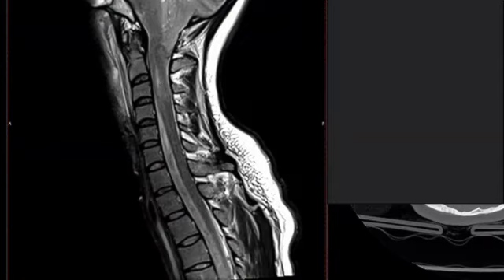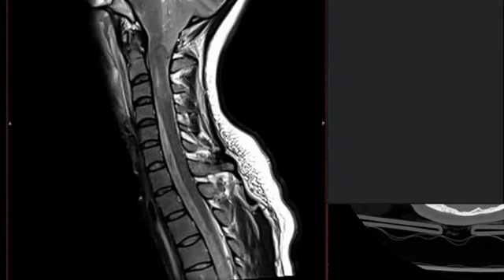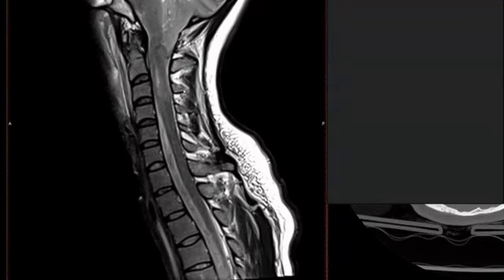What you can see here is the tip of the clivus, which is the front end of the foramen magnum, and there's the back of it. You can see the cerebellar tonsils here go all the way down. They're at the level of C2. So this is cerebellar tonsillar descent, or coning. Clearly, your cerebellar tonsil shouldn't be there. Again, this is the direct result of pressure. Once you've seen that, you can be fairly certain there's fairly significant raised intracranial pressure.